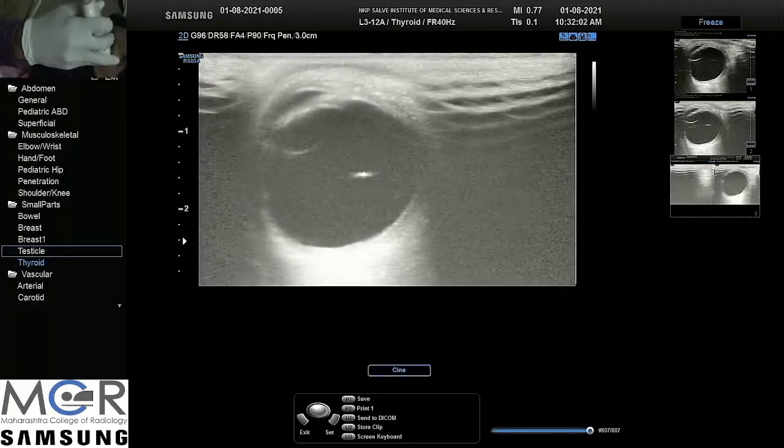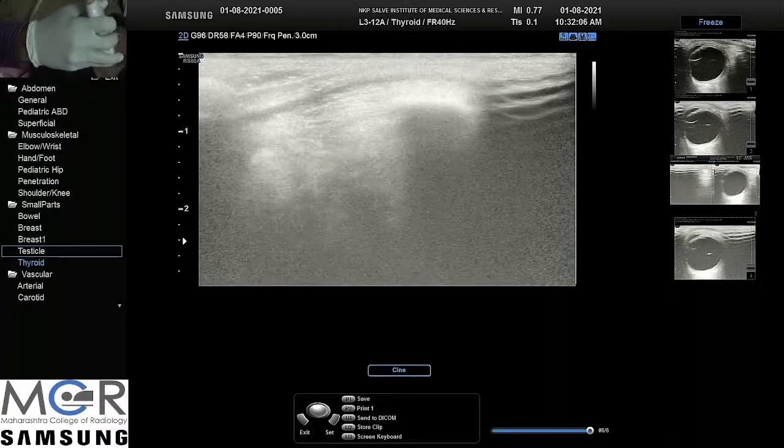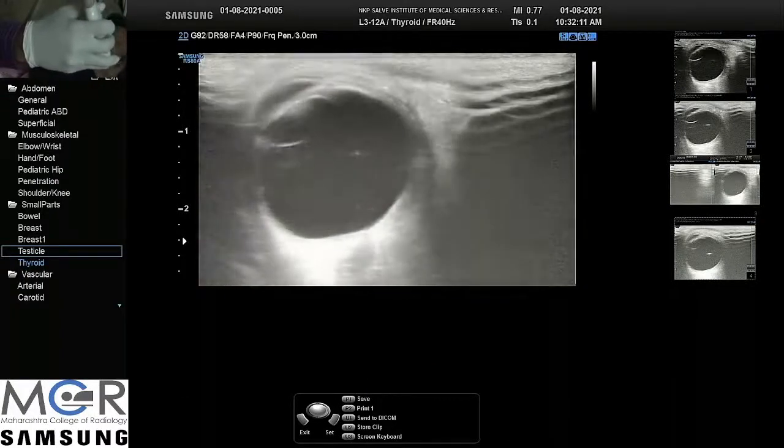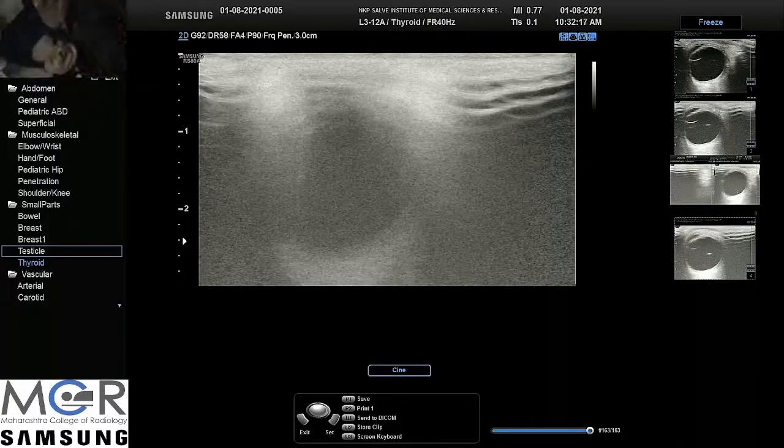Okay. So there is no other additional foreign body. Because there is an industrial area nearby our hospital, we get a lot of foreign body patients. Okay, thank you.